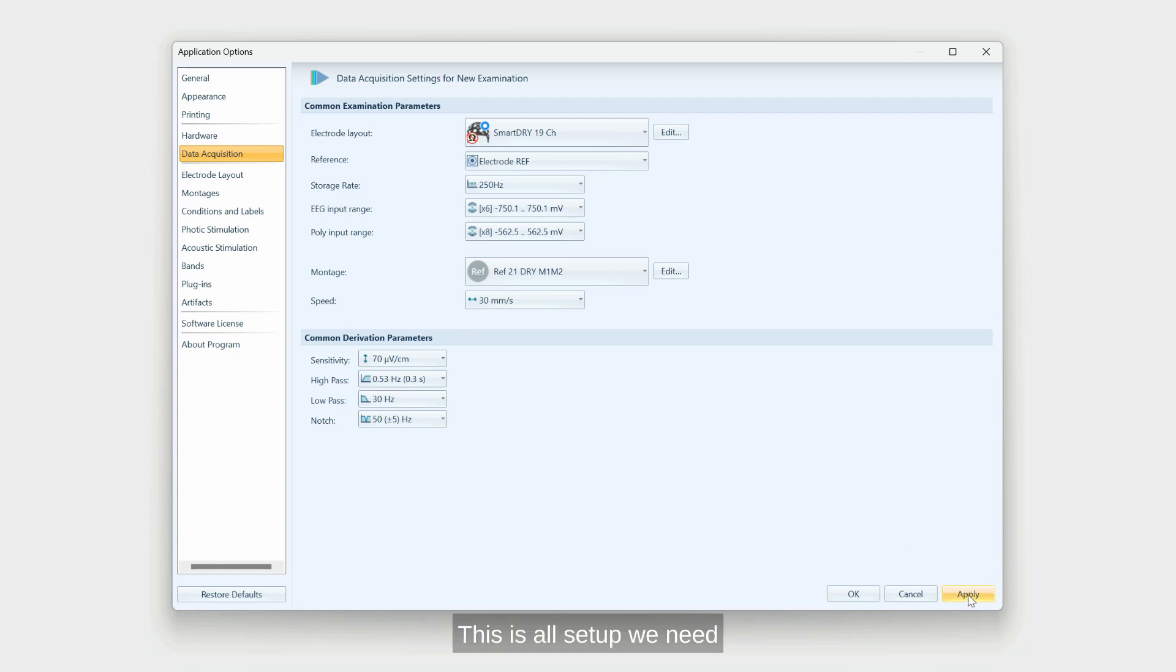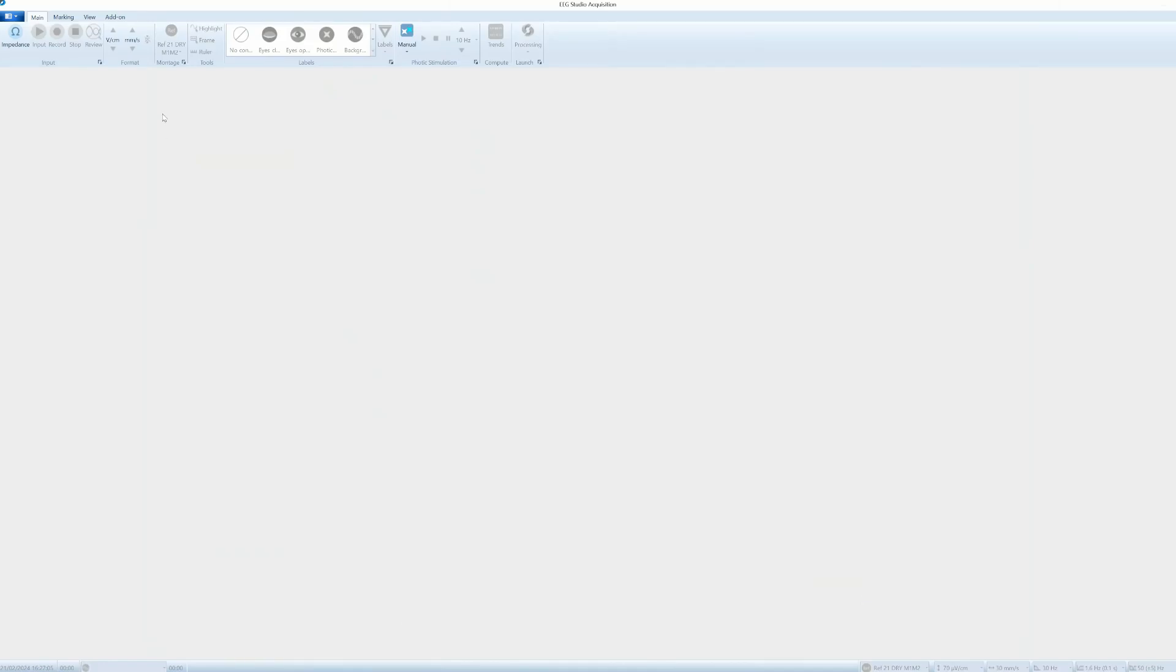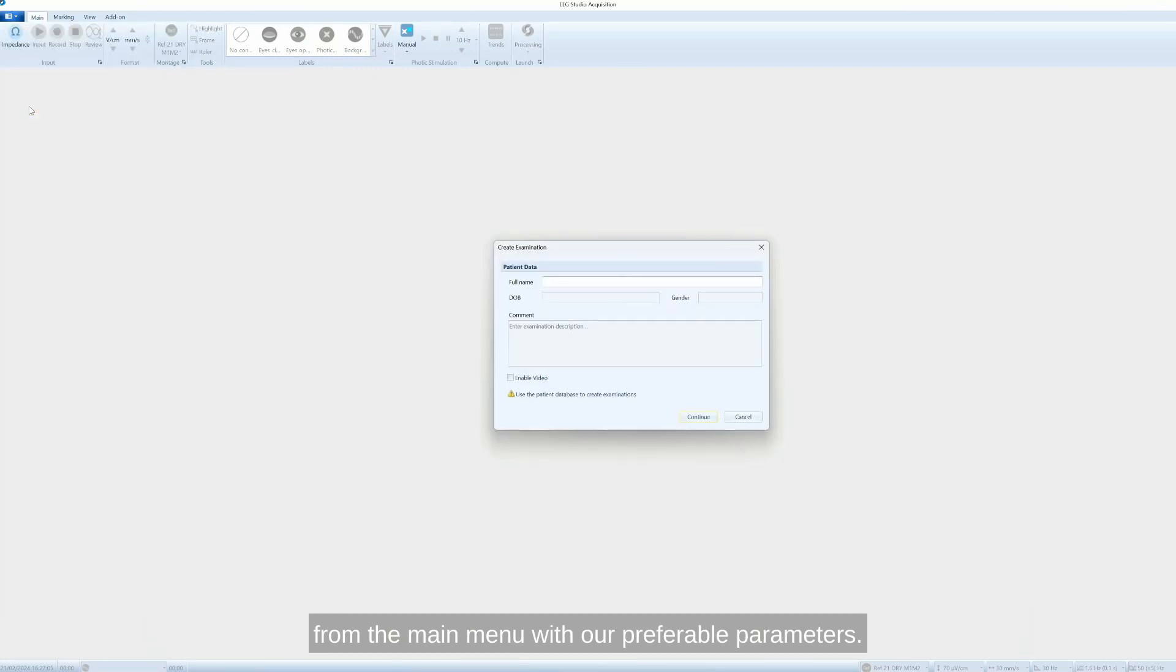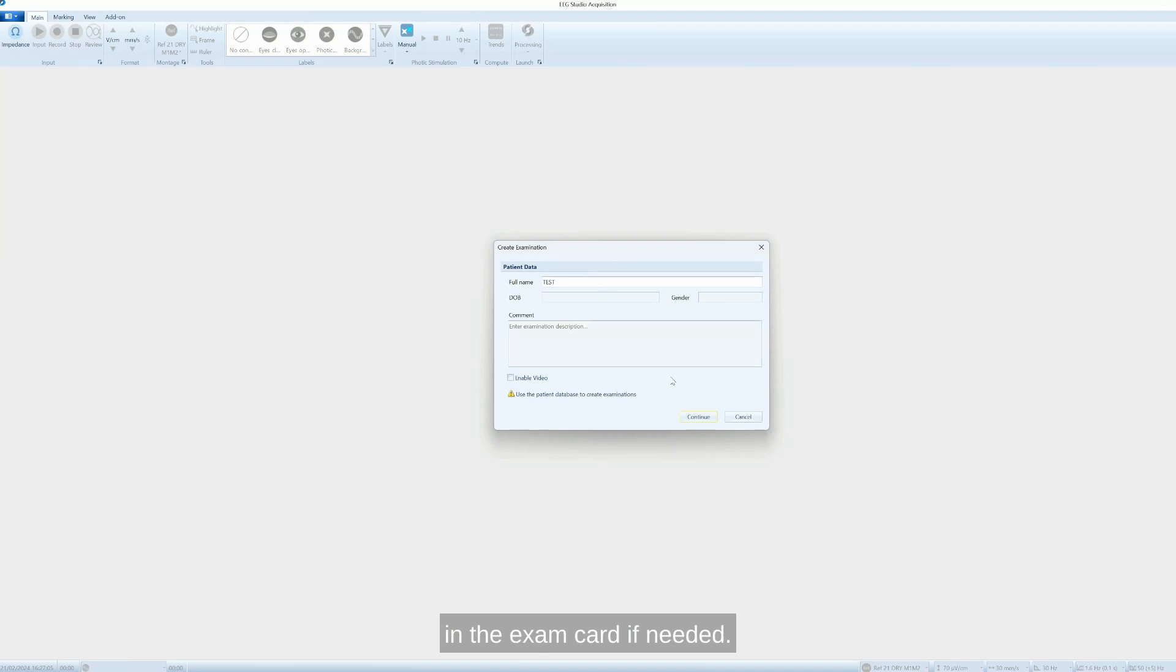Basically, this is all setup we need before starting actual EEG recording. Now we are ready to create the new examination from the main menu with our preferable parameters. In this dialog window, you can fill in the exam card if needed.